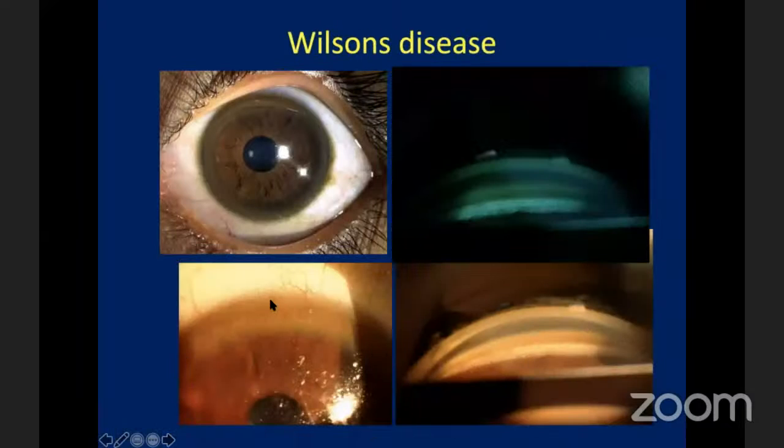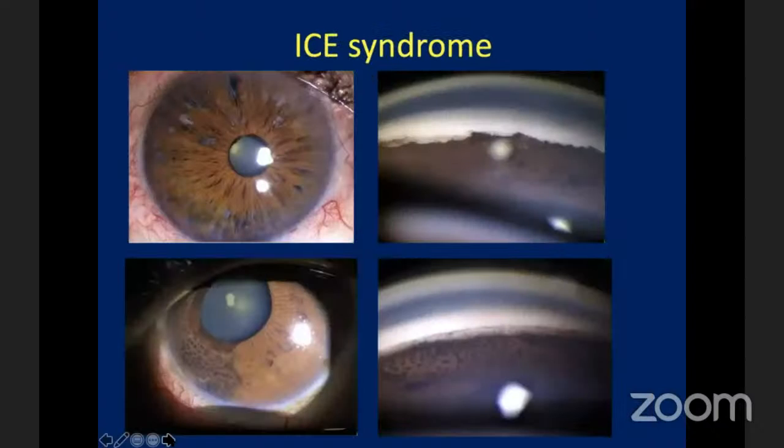And this is, of course, at AIIMS, All India Institute of Medical Sciences, we get a lot of referrals to rule out Wilson's disease. And this is a very nice gonio photograph. You can see the KF ring and this copper deposition on the Descemet's membrane that is very nicely visible through the gonioscope. So gonioscopy can be used to identify the KF ring in Wilson's disease.